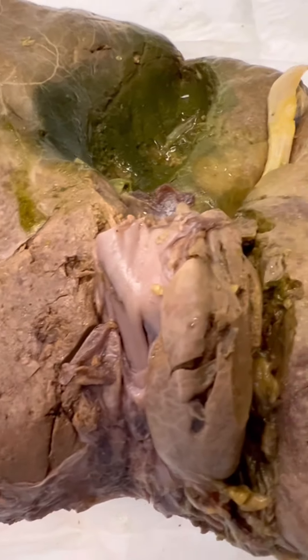We're viewing the undersurface of the liver — it's pretty normal looking. It weighed 1,300 grams. Once we flip it over, you can see that it's a pretty normal looking liver. Maybe some fatty change in it, but we'll see once we cut into it and see what else is going on.